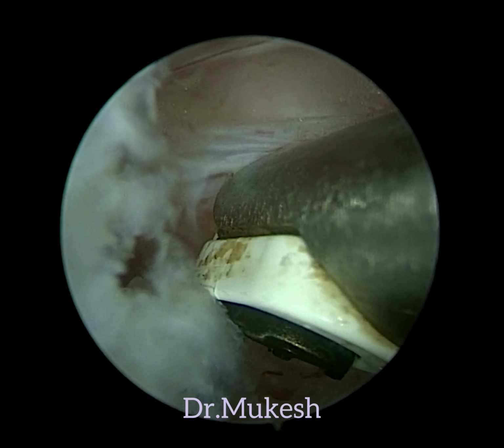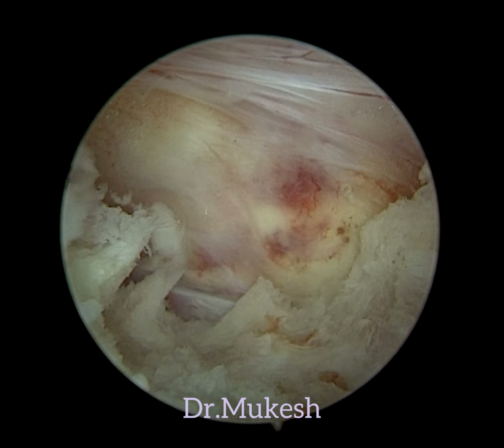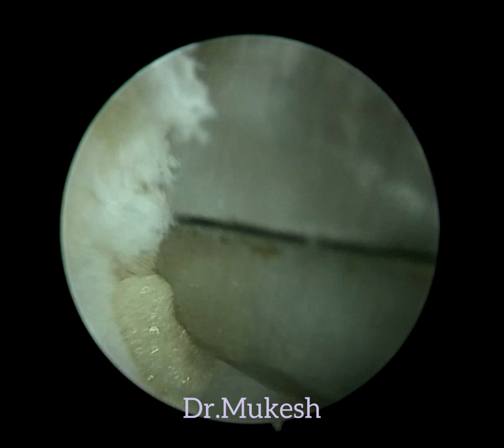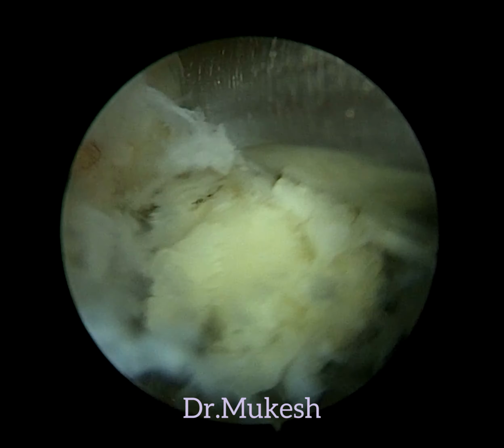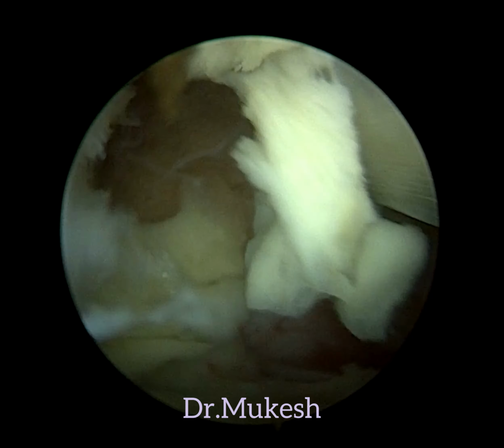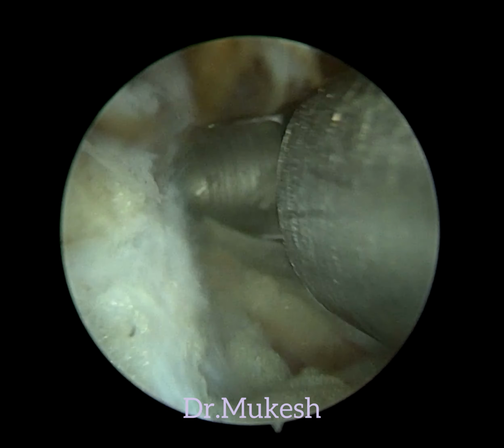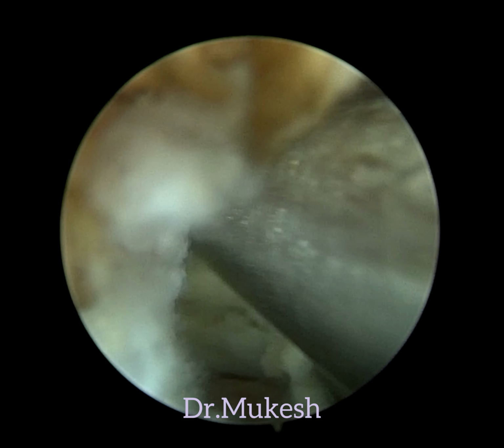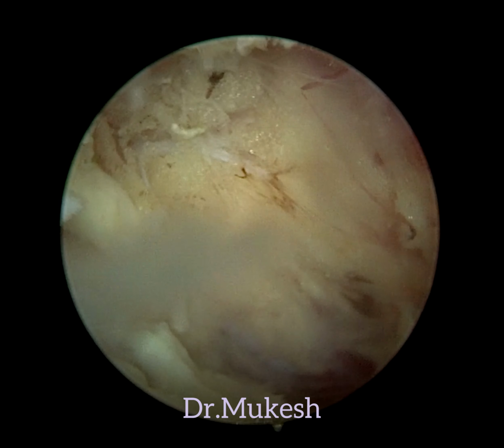So in this case, decompression was mainly focused on lower lamina, and in such type of cases we need to plan accordingly the port sites, because this was caudally migrated, so ports were slightly shifted caudally, so that it should be easy to take out that caudally migrated fragment.